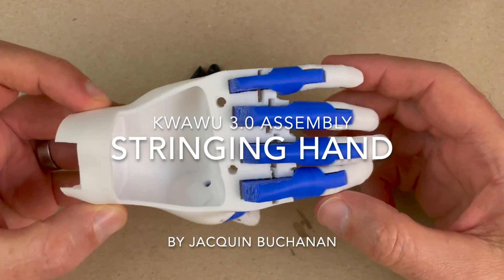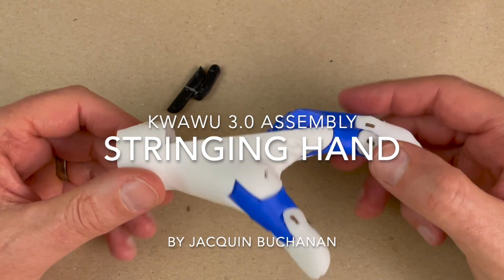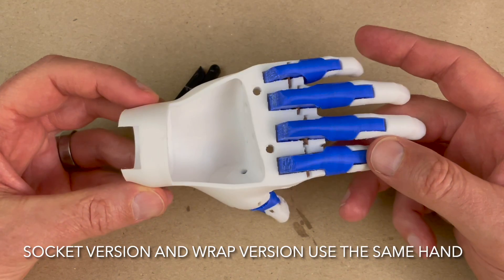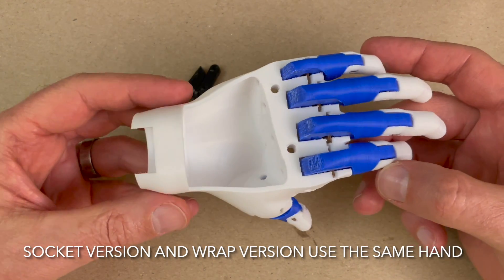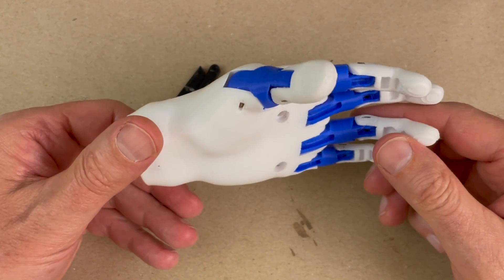I want to do another quick video showing you how to string this hand. This is a small child's hand — it should be the smallest size that the QuaWoo 3 will print. I thought I would do that as the example of stringing. It's a lot easier to string the QuaWoo 3 than it was the QuaWoo 2, so I just wanted to show that real quick.